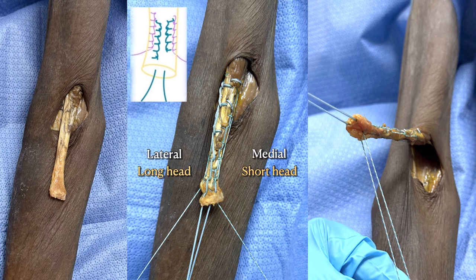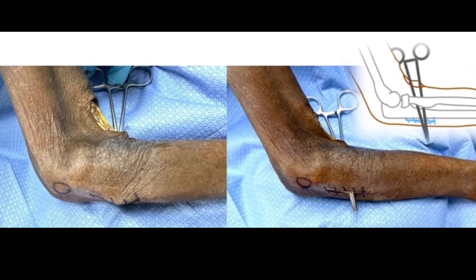At this point, keep in mind that the short head of the biceps tendon is medial and inserted distally on the radial tuberosity. A Kelly clamp is used to create a tunnel for the tendon pathway under the radius to the dorsal lateral aspect of the proximal forearm. A longitudinal skin incision is made at the tip of the Kelly clamp. The radial tuberosity is identified while the forearm is pronated.